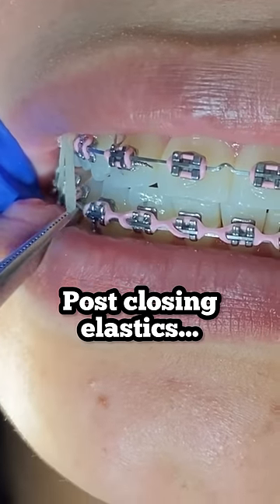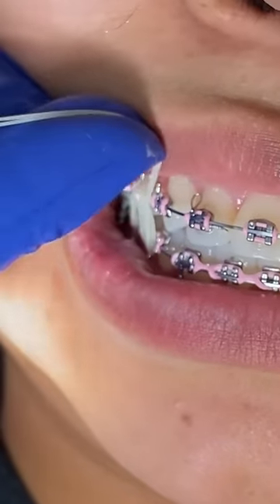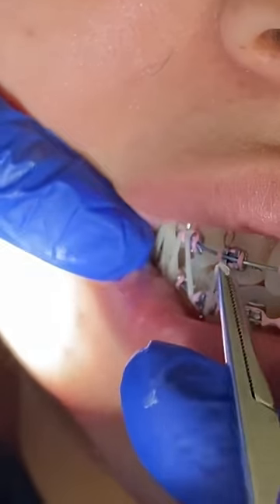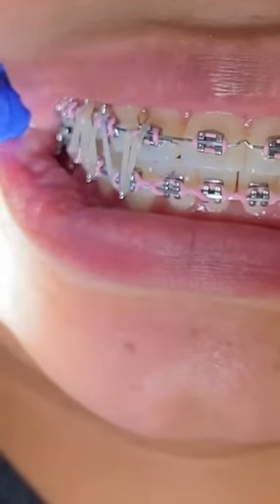These are a little bit more aggressive and yes, sometimes a little bit more difficult to put on. But it's going to become second nature when you give yourself a little bit more practice, and placing them on — especially where you don't even have to use a mirror.